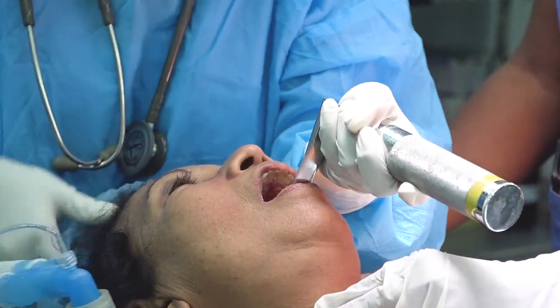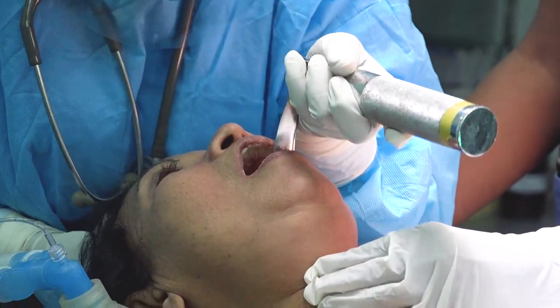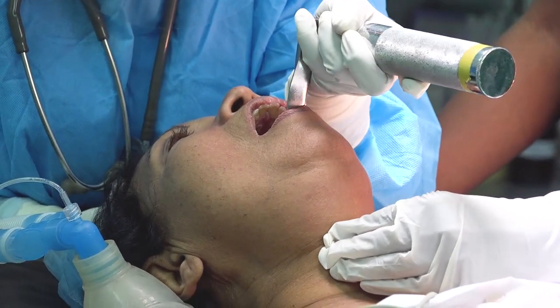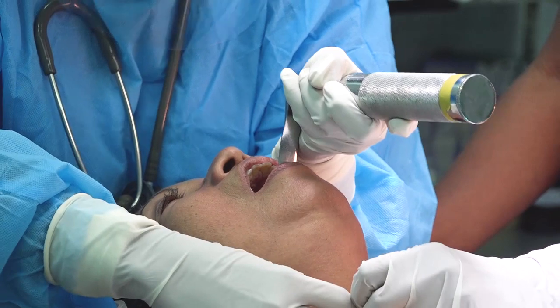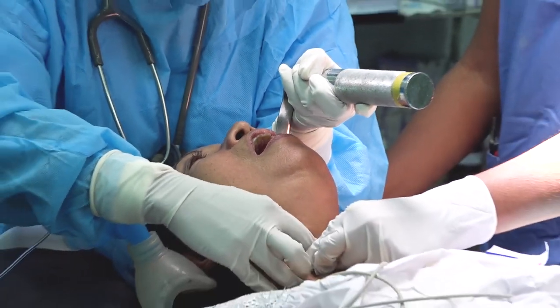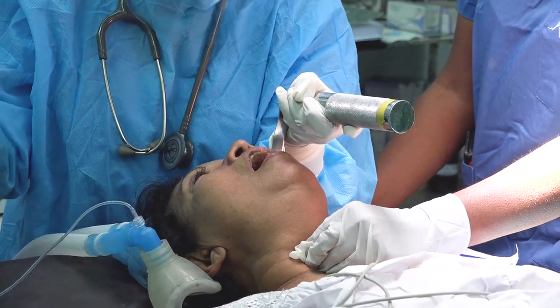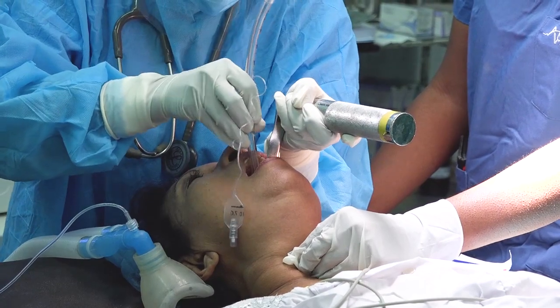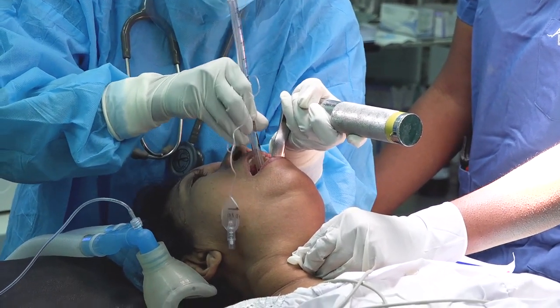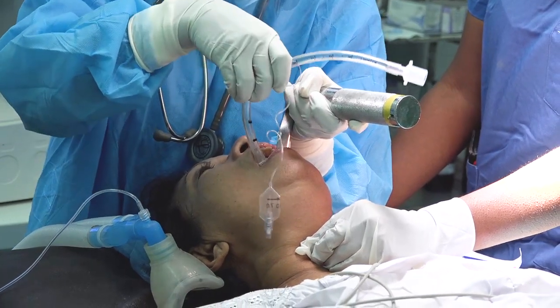Now for direct laryngoscopy and intubation, you should bring the axis of the mouth, pharynx and the larynx into one line of vision. For that, place a pillow under the head and flex the neck, and also do a gentle extension of the head. If you are a right-handed person, hold the laryngoscope with your left hand and insert the endotracheal tube using your right hand.